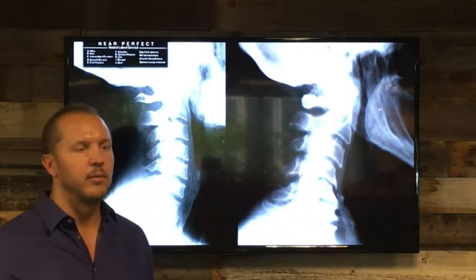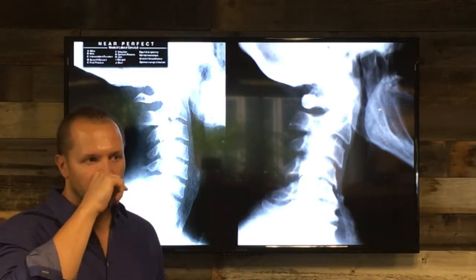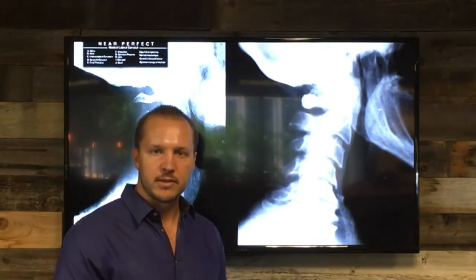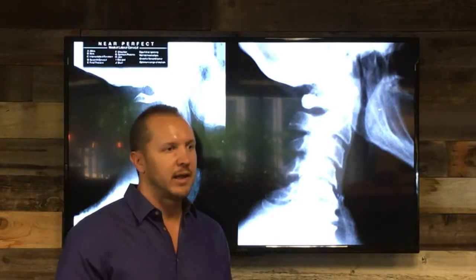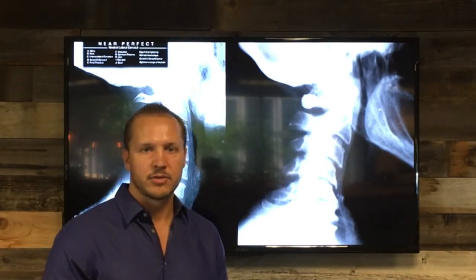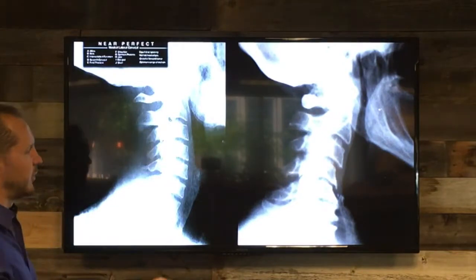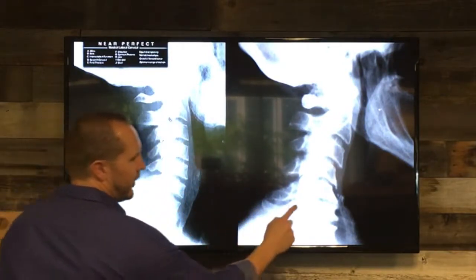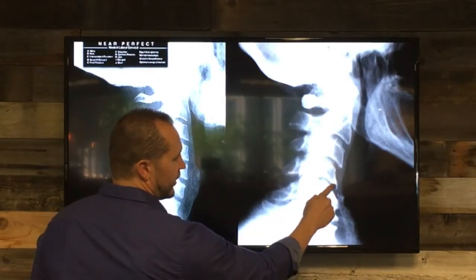This can lead to a number of different medical concerns. You can Google those yourself, but anything from reduced range of motion, increased discomfort, increased pain. It can even lead to paralysis if it gets strong enough. But I want you to notice a couple things. See the spacing on a healthy neck, and then see how we're losing spacing here and here.